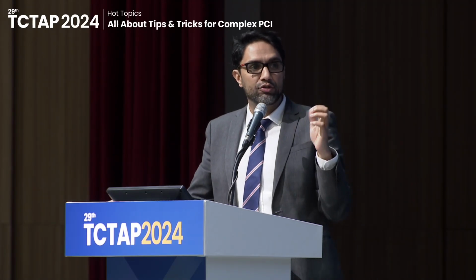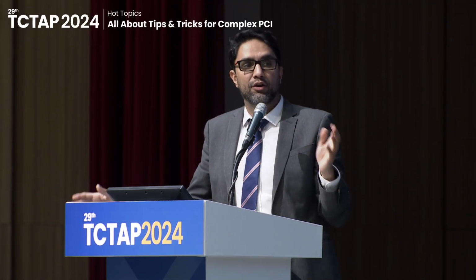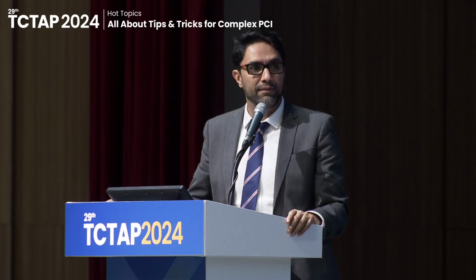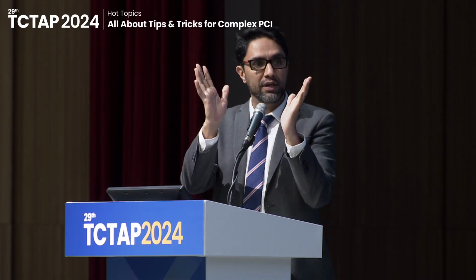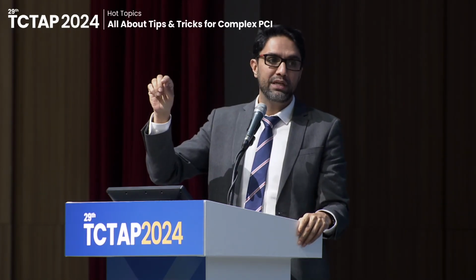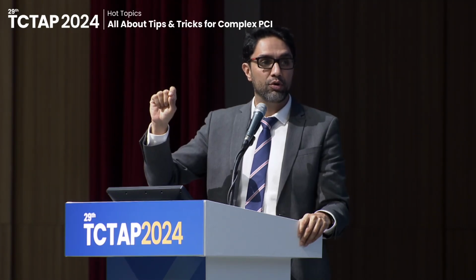Yes, and it's absolutely critical. So while the engineers will tell you that there's no directionality to this device, there is 100% directionality. You don't know which way the emitter is facing. The energy comes out like an upside down volcano, like an eruption. So whichever way the emitter is pointing, that is where the maximum amount of energy will go.